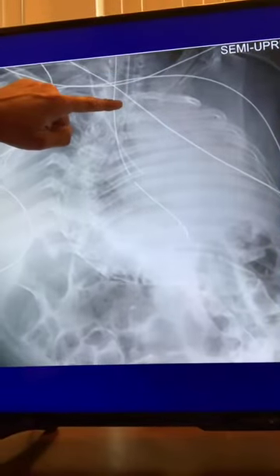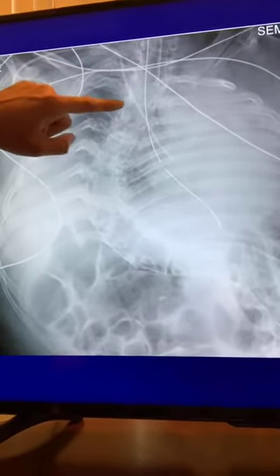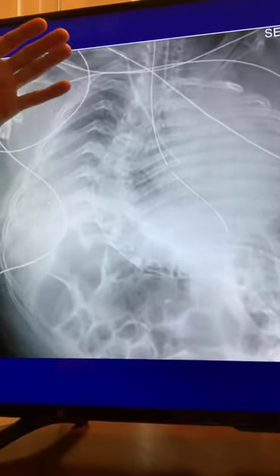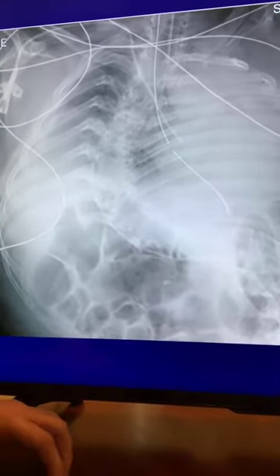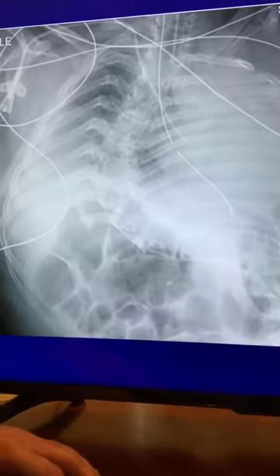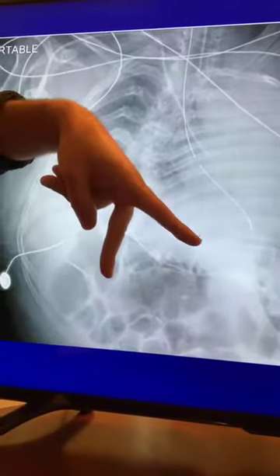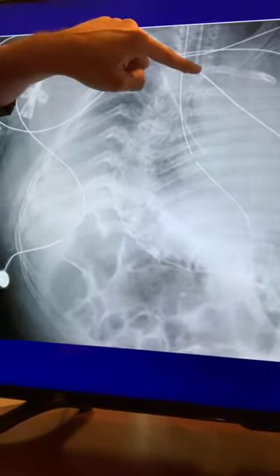First things first, this dude's intubated. I don't know if you saw that, but this is the ET tube and it's kind of high. You kind of see where the carina is. You kind of don't. It's tough to see on this image, but you want it about 5 cm above the carina. Remember, the carina is the bifurcation of the mainstem bronchi. So this ET tube is kind of high. This is like the thoracic inlet right here, but it's there. All right, so the dude's tubed.